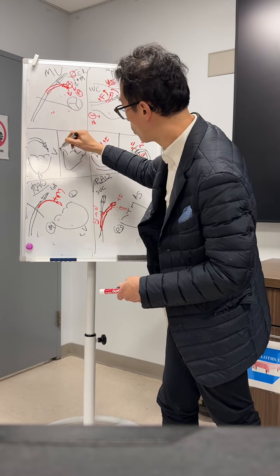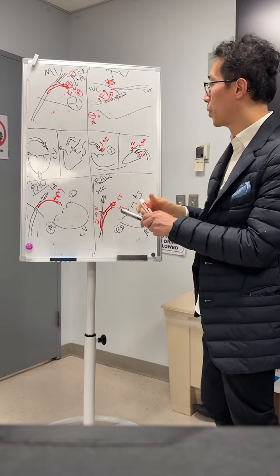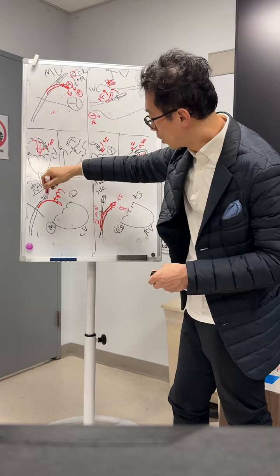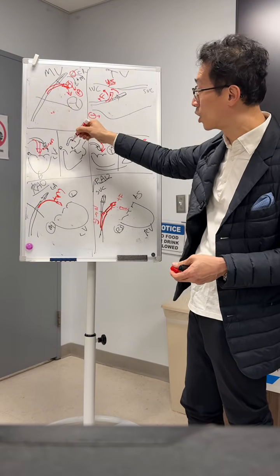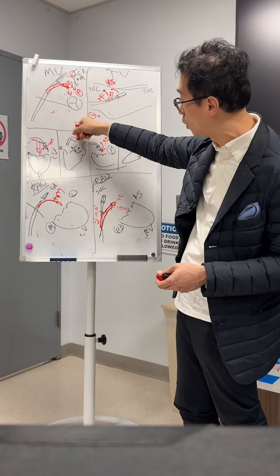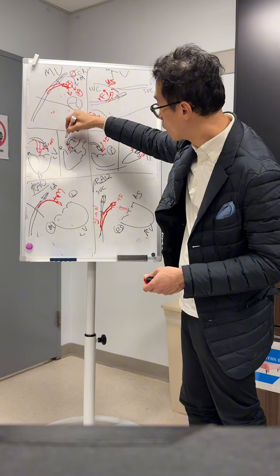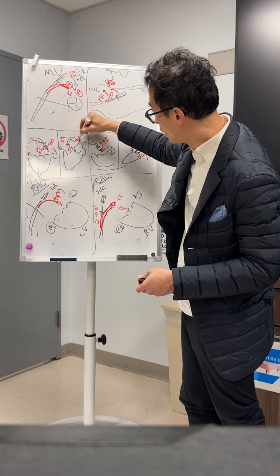okay, you see where you are here, right? Remember this is A, P, lateral, medial, okay? So now on the bicommissural X-plane, you're M-ing this way, right? This is plus M, and you're trying to get it down to here. So when you do the M, you kind of correspond to see where you are. Now you don't know how anterior posterior you are, so you need to use this view. You don't want to be up here, posterior, then you need to counterclock the guy to go back to this center, or if you're too much going towards the aortic root, you need to clock to basically be able to see this here. So going this way is to clock, going this way is counterclock.